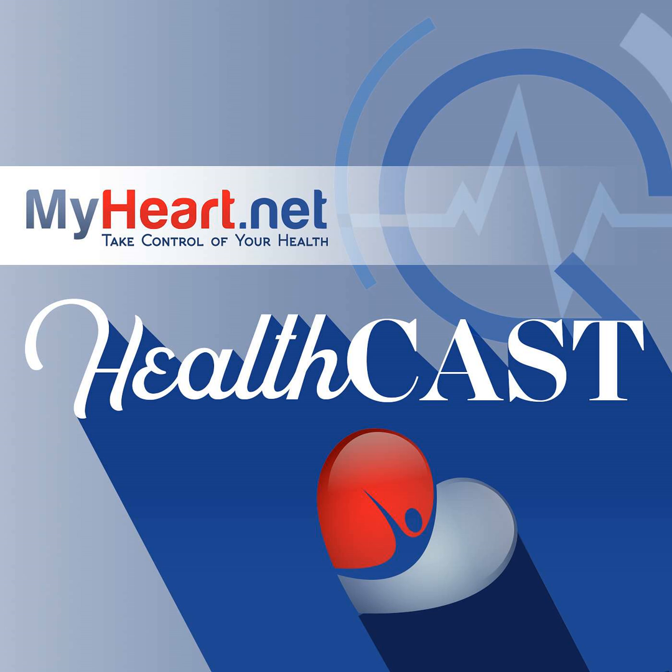Because there is some group of patients where you may not have calcification, but they still may have a non-calcified plaque, which might be causing the coronary artery obstruction and symptoms. So you might miss those patients if you just look at the calcification. For that reason alone, and of course, that's a big medical legal issue also, that is the reason we do a lot of testing, and unfortunately a lot more than what we need to do. But there is some role.